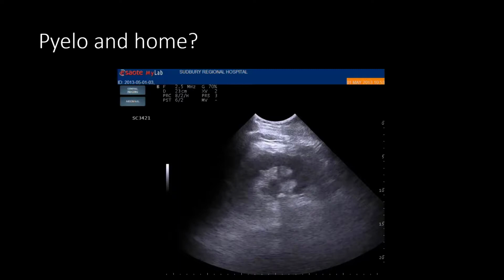And did you notice something else in this video? Good on you if you did. You can see it right here, a UPJ stone.